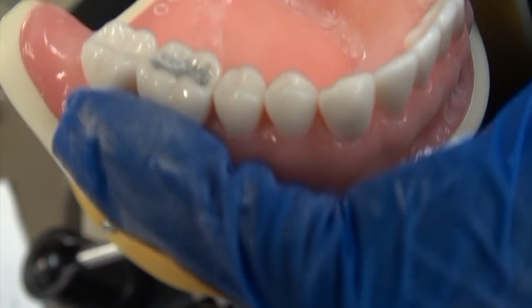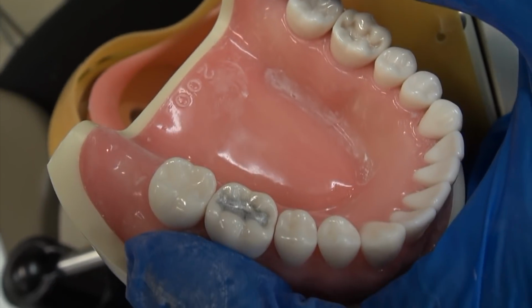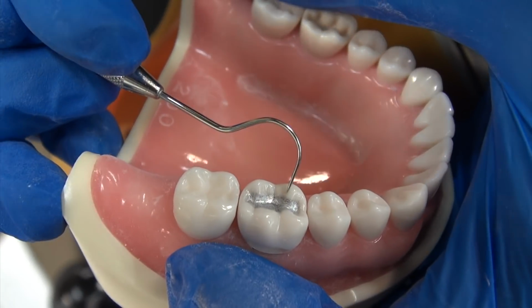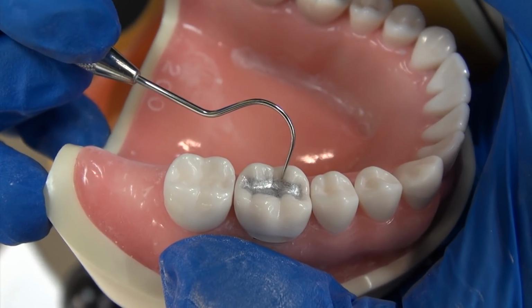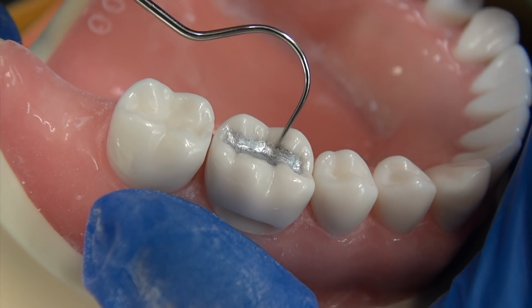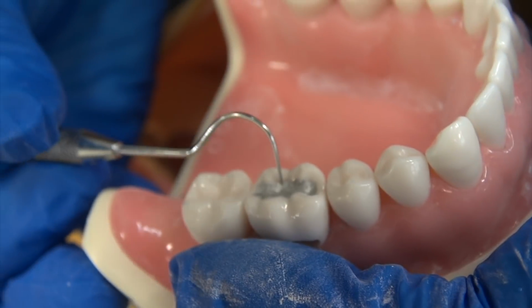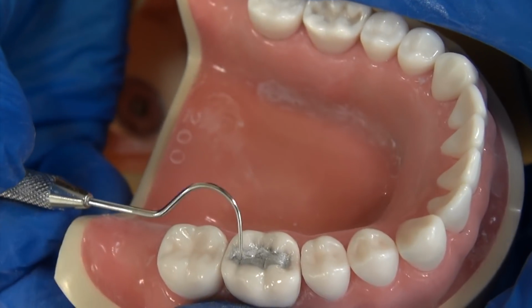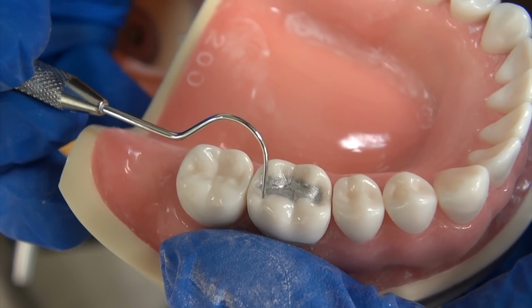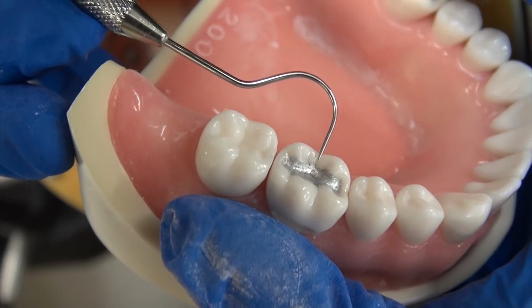Let's see. Looks like I still have a little bit of flash. Now, right here in the secondary anatomy, this is another easy area where there can be a little bit of flash that's left. It almost looks like I left a little right here. So always double check these little indentions, these little grooves right here, the secondary anatomy. So you have your primary anatomy, and then this is your secondary.